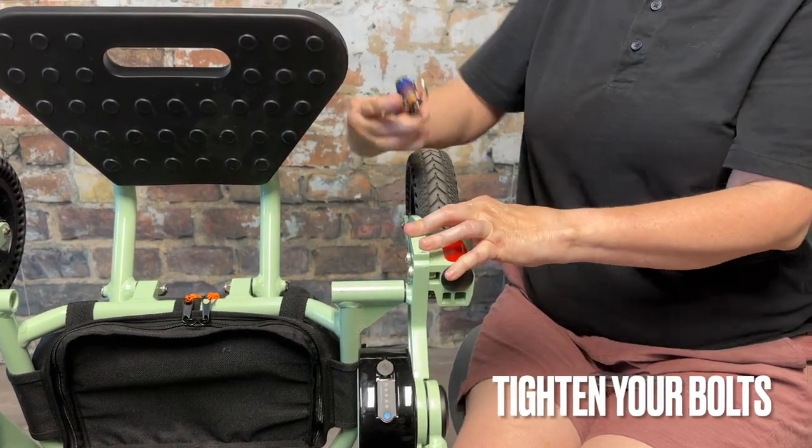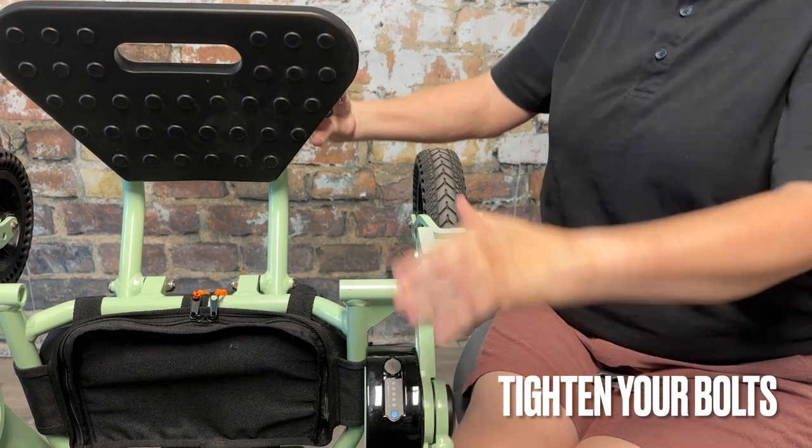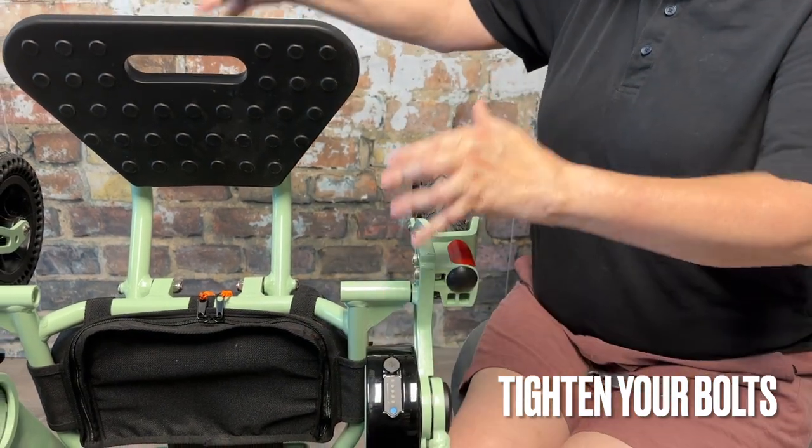Welcome to the Tighten Your Bolts video. First thing we're going to do is put the chair on its backside like it's popping a wheelie.